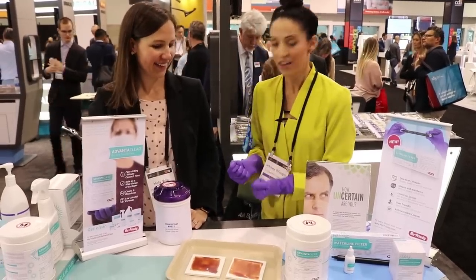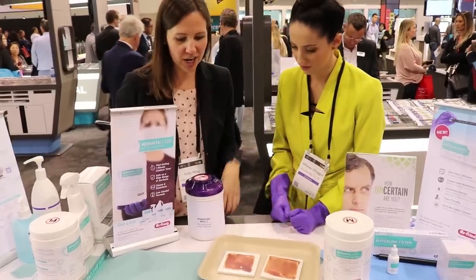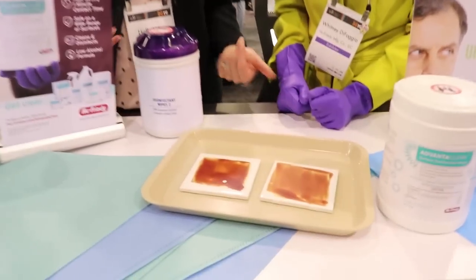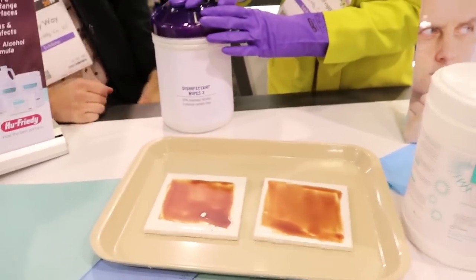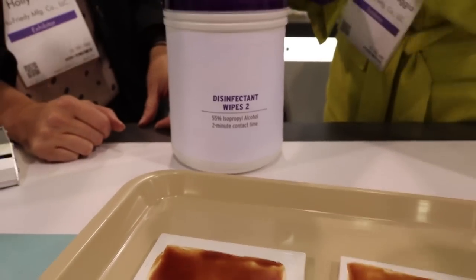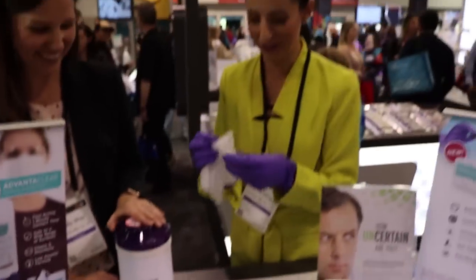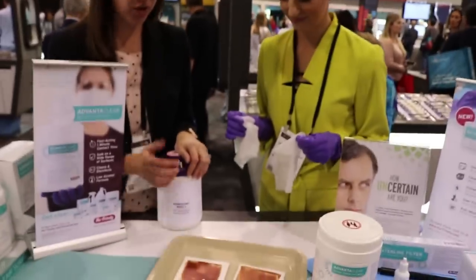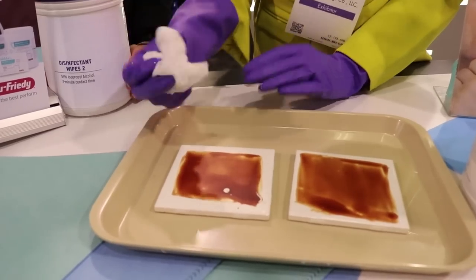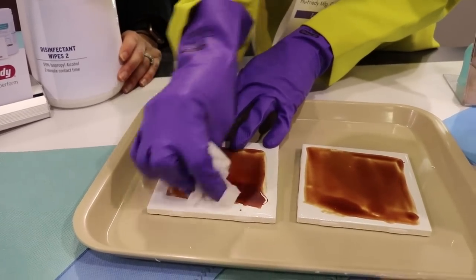Another thing is disinfectants, and Holly's going to walk me through. So we're going to do a blood tile demonstration which will show debris within a surface. First you're going to take two wipes of this high alcohol competitive product and try to clean the blood off of that tile. So I'm doing a blood tile test — this is sterilized blood on a tile.